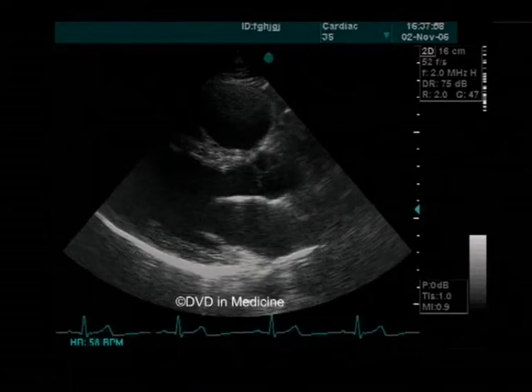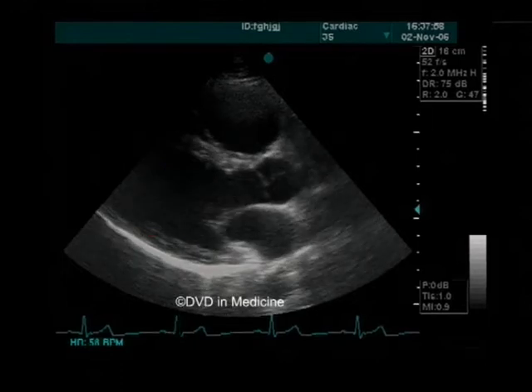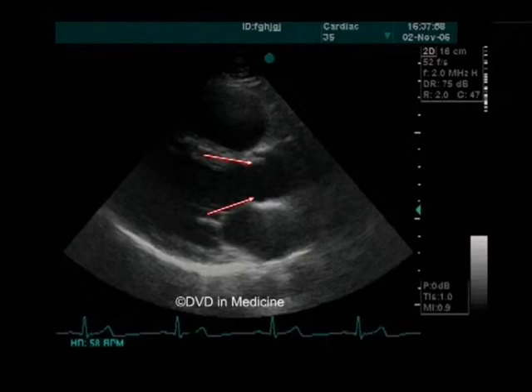This is called early diastolic closure of the mitral leaflets. The second opening of the mitral leaflets in diastole is a result of late diastolic blood flow in the left ventricle after the systole of the left atrium. The amplitude of the second opening of the mitral valve leaflets is lower than the early diastolic opening. After the completion of the second opening, one will see the start of the left ventricular systole and the mitral valve leaflets close. In a very short period of time after the mitral valve closure, one will see the opening of the aortic valve leaflets.